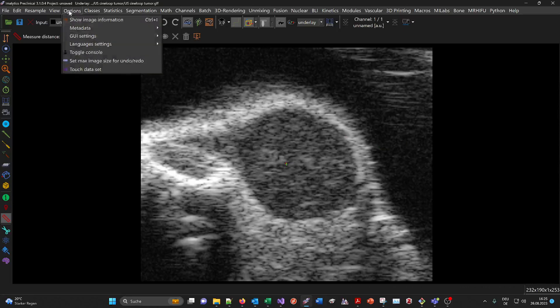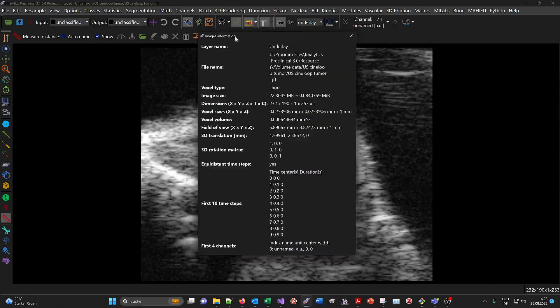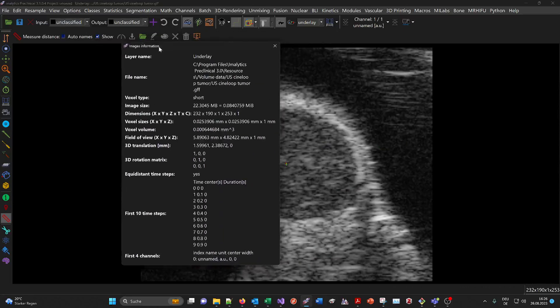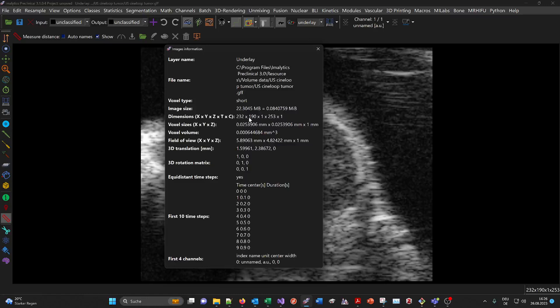You can check the properties of the volume here. This shows the voxels in X and Y, and you have 253 time points. The voxel size is around 25 micrometers by 25 micrometers.